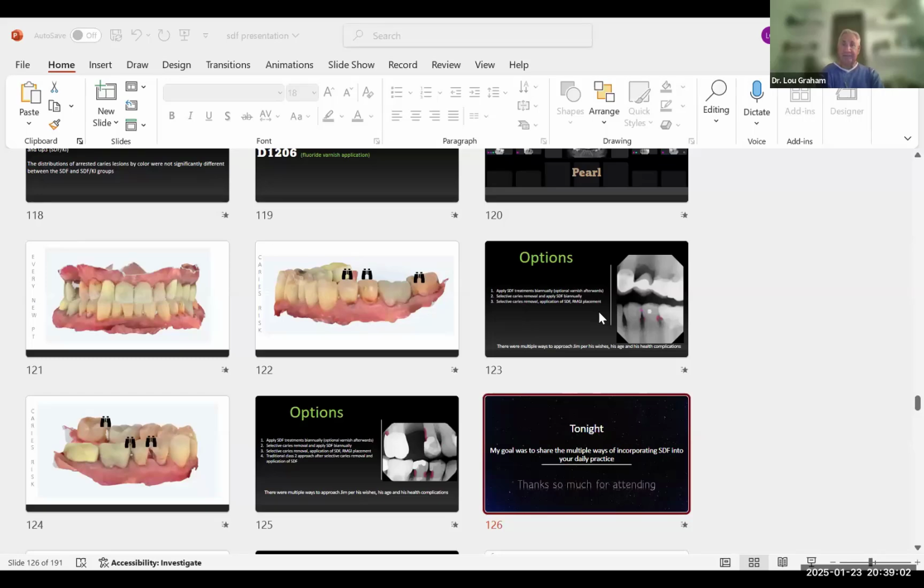Well, once you're down 5, 6, or 7 millimeters, the literature supports removing all the caries on your walls, and you can leave caries on the floor. And that caries on the floor is best treated with silver diamine fluoride, no doubt about it, because it will penetrate all 3 layers, the infected, affected, and get to healthy. And that's what I love about this product. But no, on an early caries or early moderate, take out all the infected and affected dentin for sure.